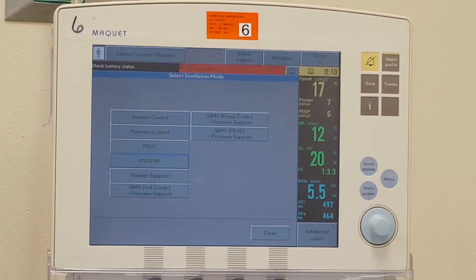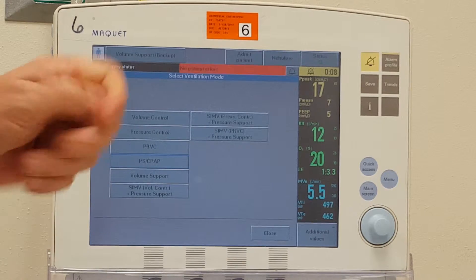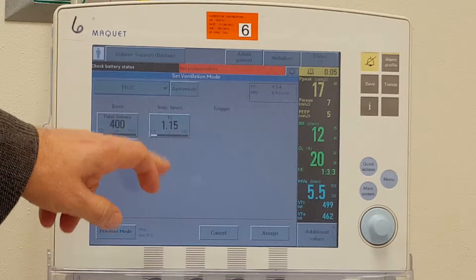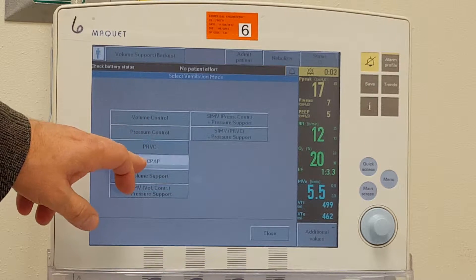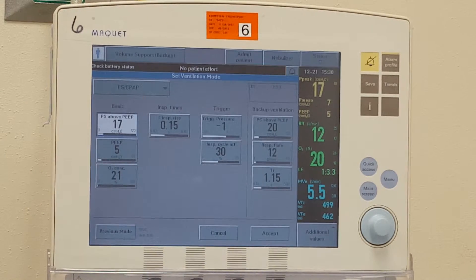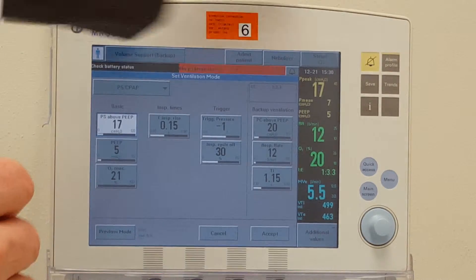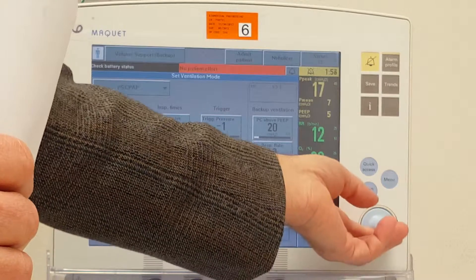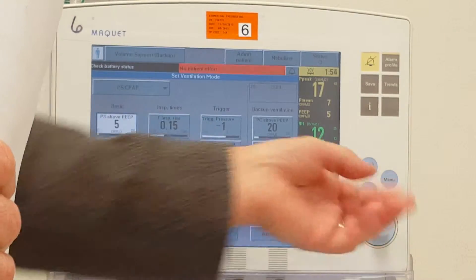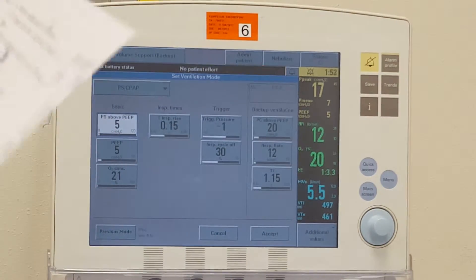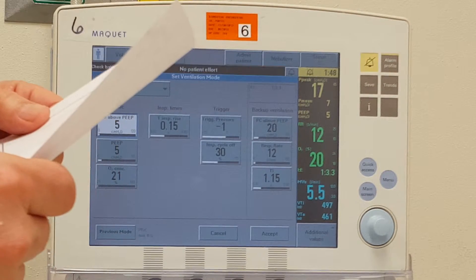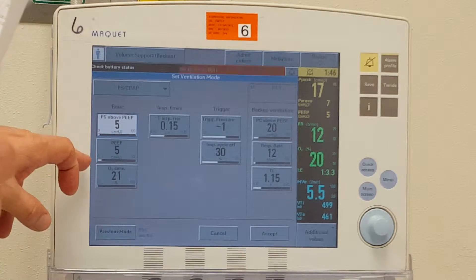We want to set the patient up in pressure support CPAP. You can see here pressure support CPAP. I'm not sure how much this patient needs, so I'm going to initially just set them on a pressure support of 5, and then we are going to adjust that to get as much volume as the patient needs. Pressure support CPAP of 5.